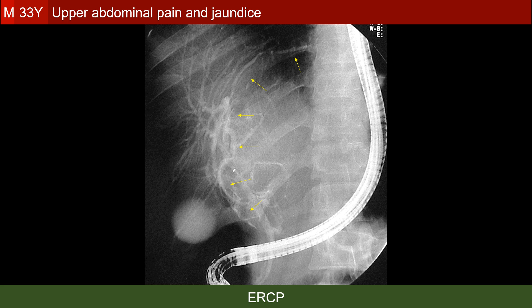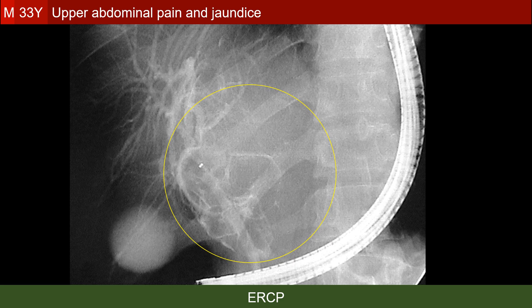ERCP showed displacement of the bile ducts by the left lobe lesion, and showed two other important signs. First, the extravasation of contrast agent outside the bile ducts. Here is a magnified view — it is clear that the contrast medium lines do not fit with the ramifications of the bile ducts, and therefore they are most probably extravasations.